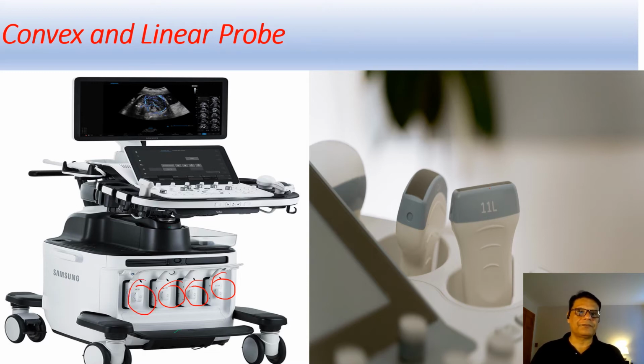And seeing the top of the ultrasound image, you can tell which transducer has created this image. So the top is curved and it's like coming like this. So this image is produced by this convex. And if the image would be like this, so that would be produced by the linear transducer.